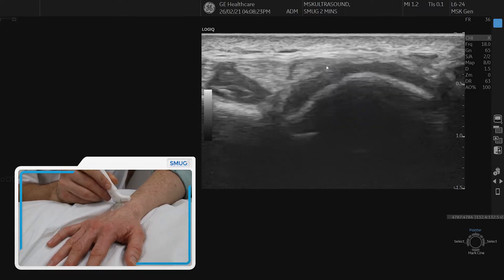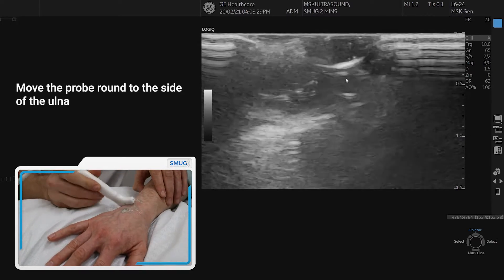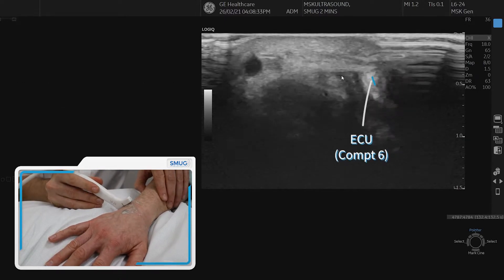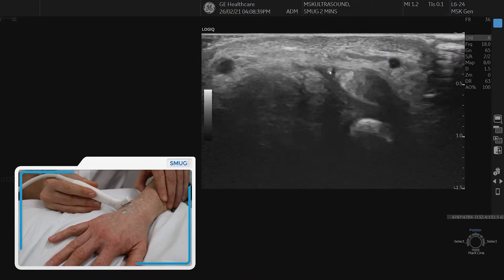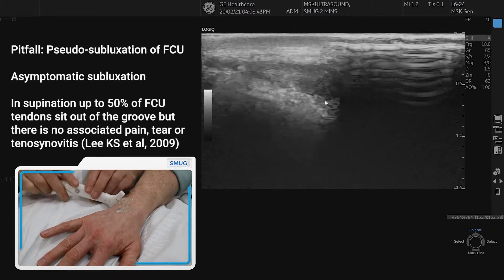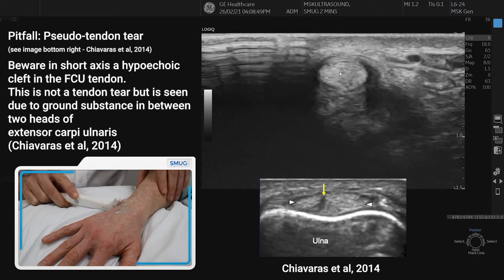Right over the side of the ulnar is our last compartment, which is compartment six — that is extensor carpi ulnaris. You can see it's got a nice thick retinaculum over the top, and if we go back more proximally you can see that it sits in its own little groove on the side of the ulnar, and we can follow that down to assess the tendon.